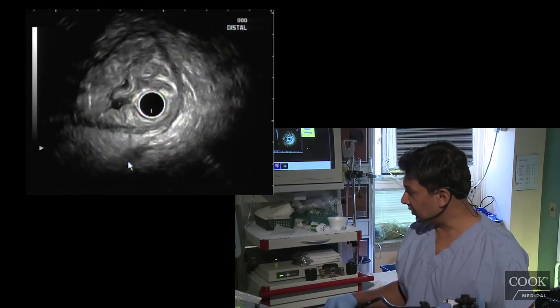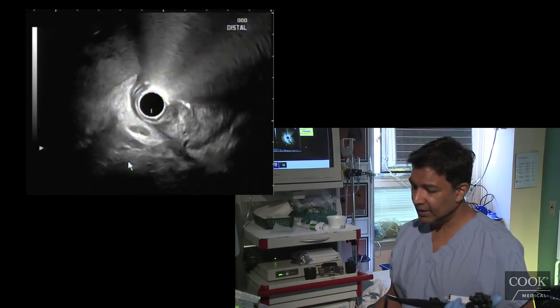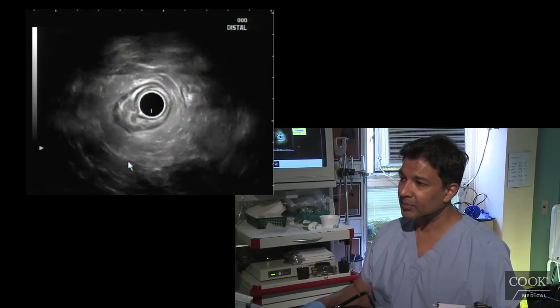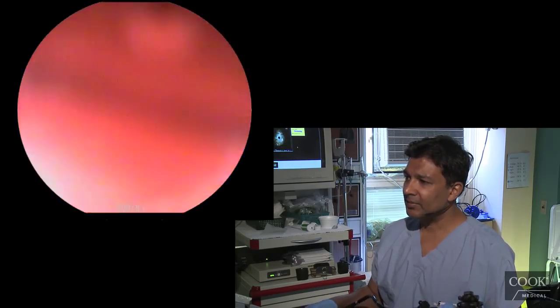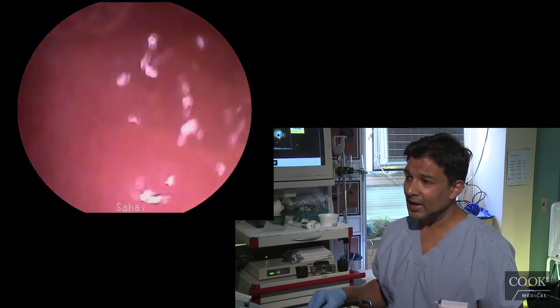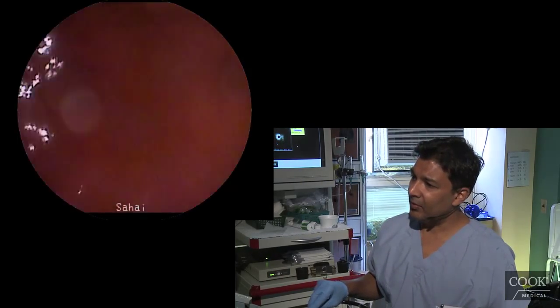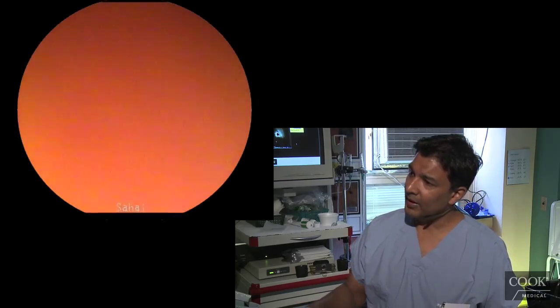Not much else — no signs of portal hypertension, gastric varices, or anything like that. We're going to go into the bulb now. You can sometimes see the bile duct from the stomach with the radial scanner, but I haven't really perfected that yet because we just don't do radial that much for pancreatic disease.